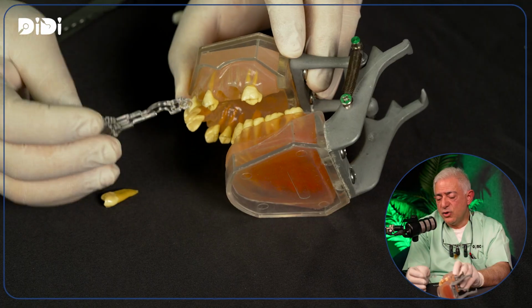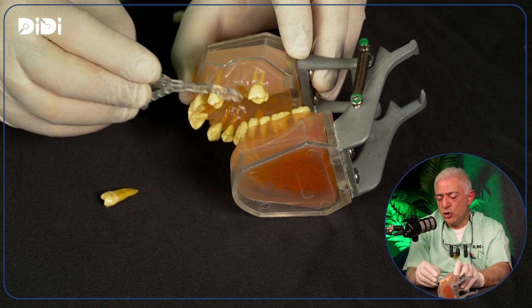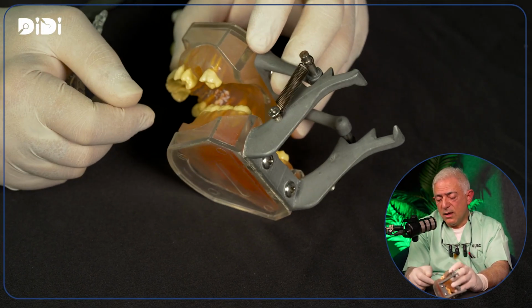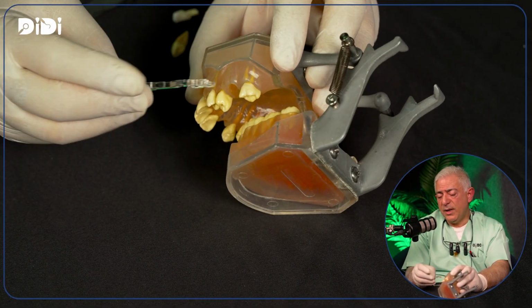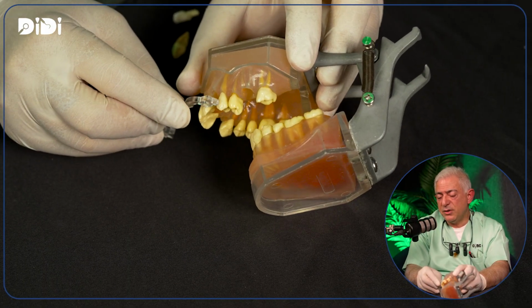Done. You can place 2 implants. Finished. Of course, you can spread it according to the size of your crown, but in 1 second, you are sure, because sometimes there are 2 teeth missing and you think you can place 2 implants, but it's not 14 millimeters.